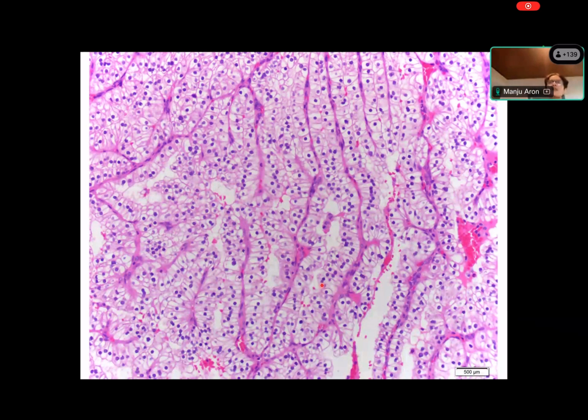And this is to show you some of the heterogeneous features that you can see with clear cell RCC. Here, it almost looks more tubular. And this is just to show you how sometimes it can also show this vague piano key-like appearance, which you see with clear cell papillary renal cell tumor. So clear cell RCC is a great mimicker. It can really look like different tumors in different areas.